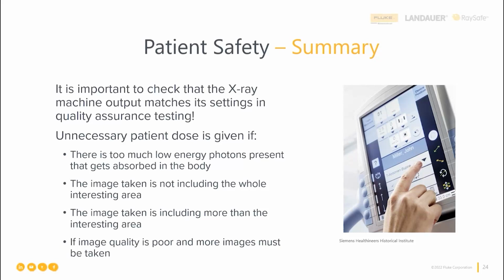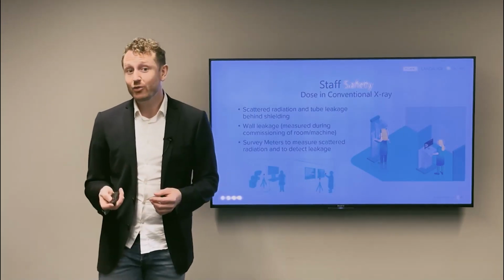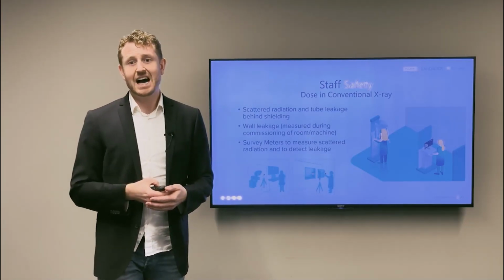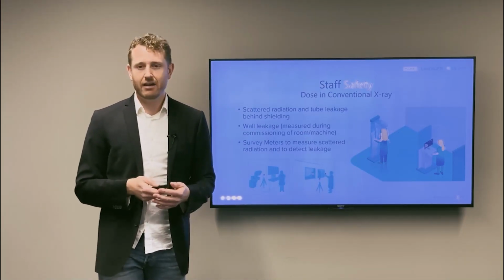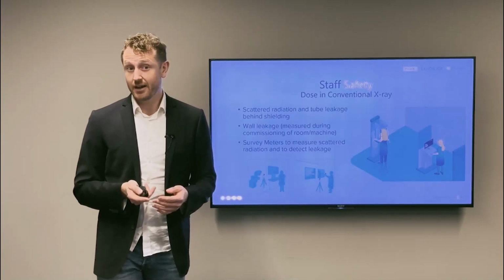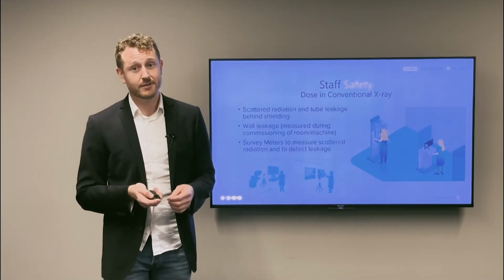We will also talk about minimizing dose to staff. In most applications, staff is not close to the source when an image is taken. They usually leave the room or go behind shielding. The patient always gets the highest dose during a procedure, but staff, on the other hand, are exposed to small amounts of radiation every day, and the accumulated dose over years can be quite high. It is therefore of utmost importance to control the environment also from a staff perspective.